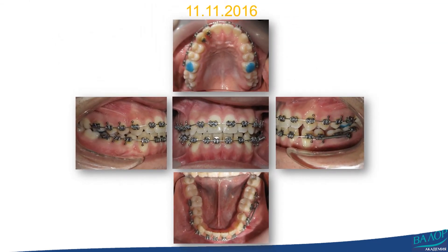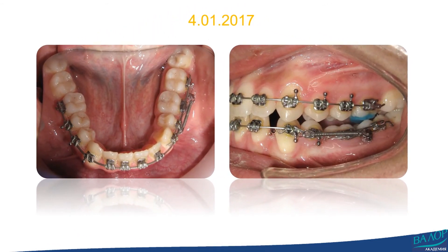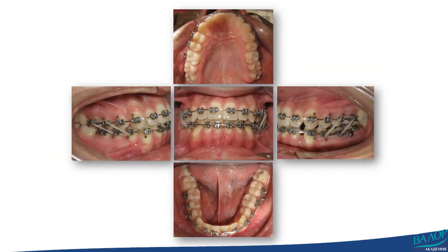In two months' time, in November 2016, things started to look much better. Alignment, midline coincidence, and minimal overbite were achieved. The arch wires were changed to 16×22 thermoactive NiTi wires. In a month, an obvious mistake was observed: distal tipping of the lower left canine because of the force from the spring which had bent the leveling arch wire. This is the reason why sliding mechanics should be avoided while using non-steel arch wires. Changing the arch wire to 16×22 stainless steel became a must, along with a passive laceback on the canine to allow root movement in the distal direction. Class 3 box elastics were placed for better occlusal settling and a power chain for further space closure.